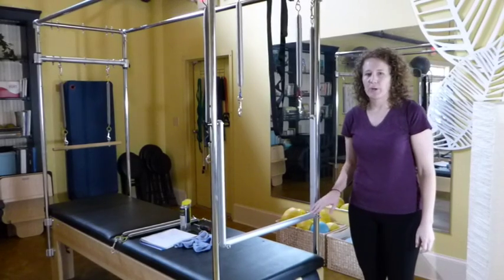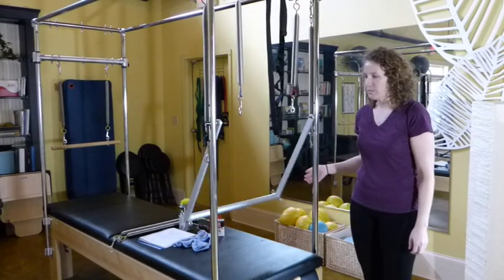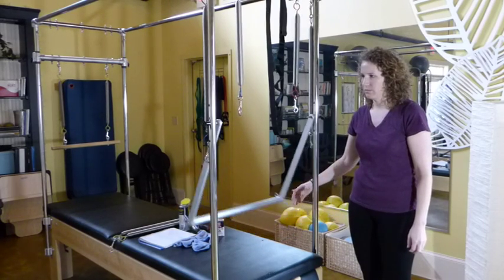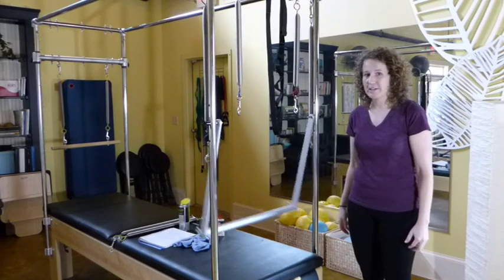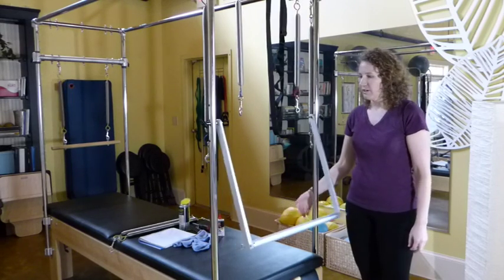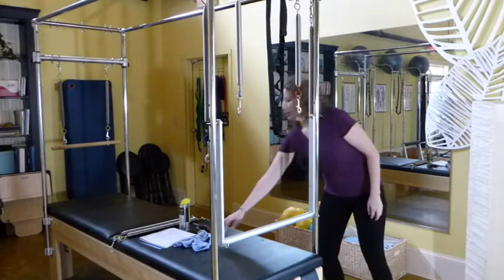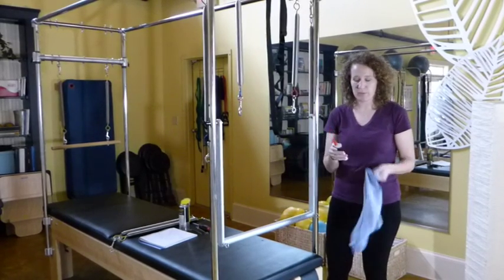Let's check the push-through bar. I like to just let it swing a little bit and listen for noise. This one's pretty quiet, but usually you can hear a nice, loud, grinding or squeaky noise, kind of like moaning. And to fix that, we're just going to add some oil to the T-pins. So take a rag and take your 3-in-1 multi-purpose oil.